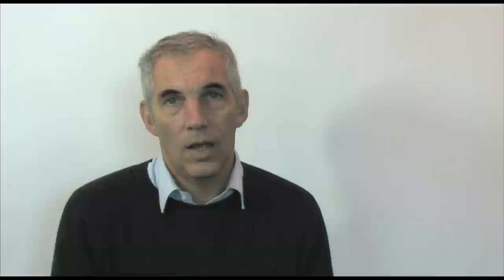Shuffle forward to the edge of the board. At this point you may wish to take a breather. When you feel ready make sure your feet are flat on the floor and stand up.